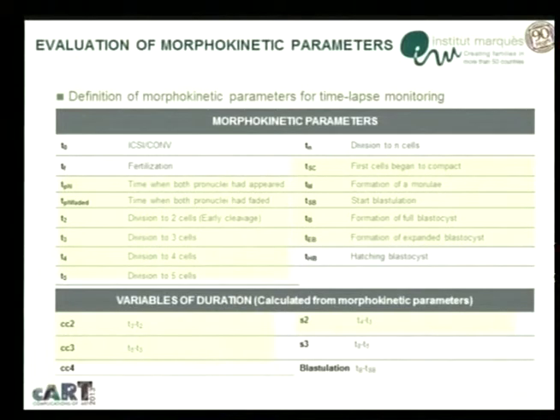So you have here all the times. T2 means time to arrive to two cells, T3, time to arrive to three cells, and this follows up. Then you have the time to arrive to start compaction, time to morula stage, time to start blastulation, time to arrive to blastocyst, and then you have expanded blastocyst and hatching blastocyst.